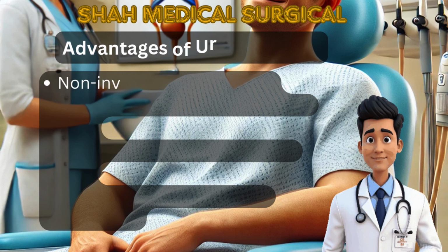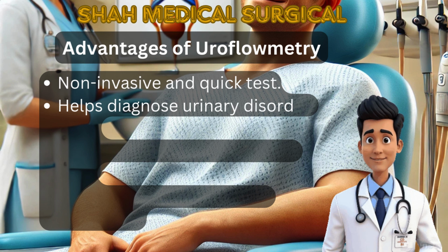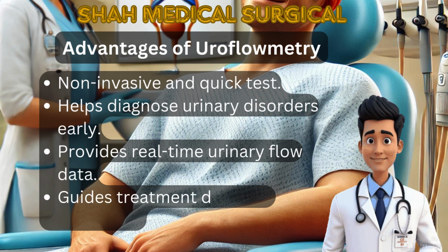Advantages of uroflowmetry. This test is quick, painless, and non-invasive, making it highly convenient. It allows early detection of urinary disorders, preventing complications. By providing real-time data, it helps doctors make accurate diagnoses. Uroflowmetry also helps in monitoring treatment success over time.